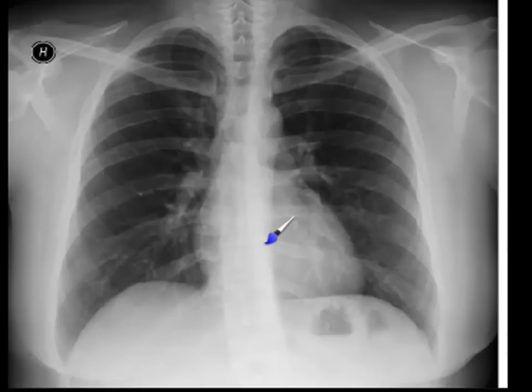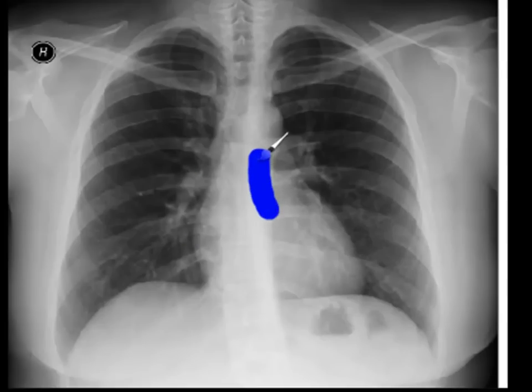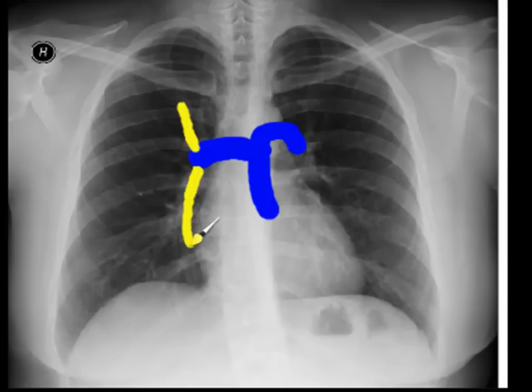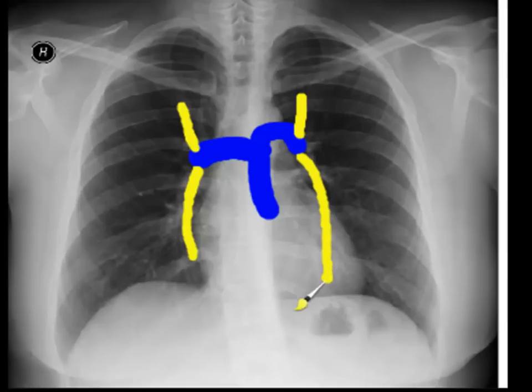A normal chest X-ray is in front of us. I just want to show you the normal orientation of the main pulmonary artery and its branches. It arises from the right ventricle and travels upward, then divides into two. The right pulmonary artery travels almost horizontally in front of the right main bronchus. On the left side it curves up in front of the left main bronchus and comes down, giving off an upper lobe branch and an interlobe branch on the right side, and an upper lobe branch and interlobe branch on the left side. This is the normal orientation.